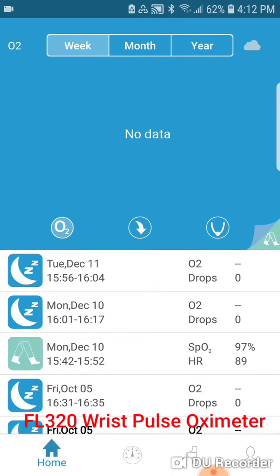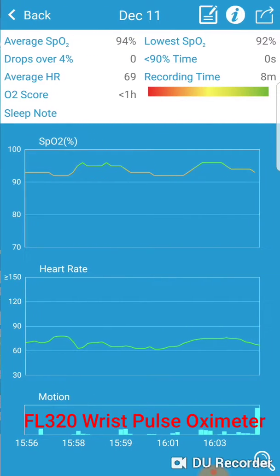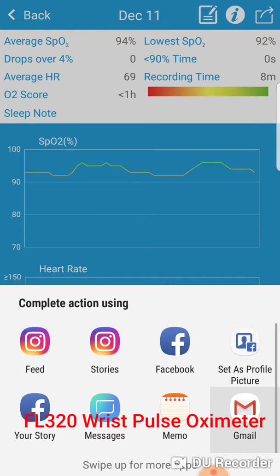The first option is the home button, which will allow you to see any of the previous reports. Clicking onto one of these reports will give you an overview of that report with your SPO2 level as well as heart rate. This report can be shared with the share button, which will allow you to send it via email, Facebook, or Instagram.